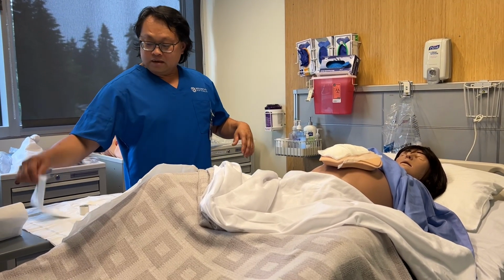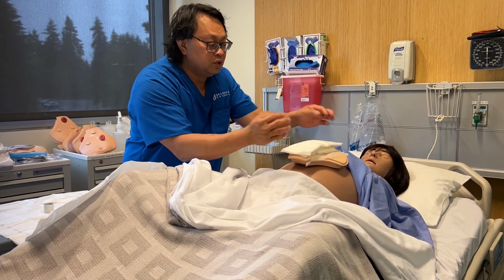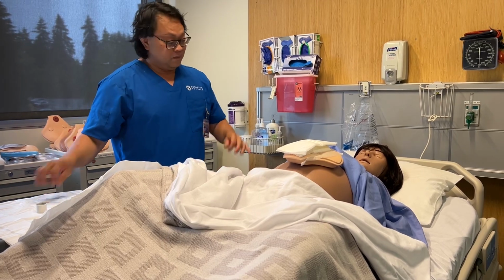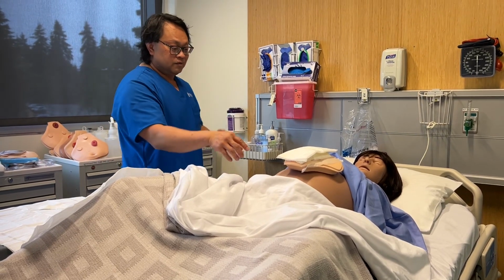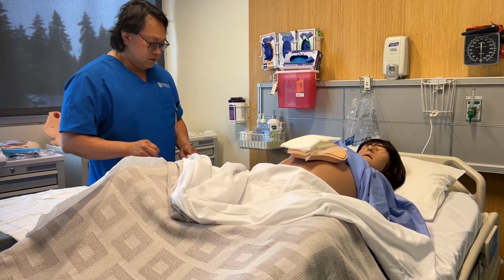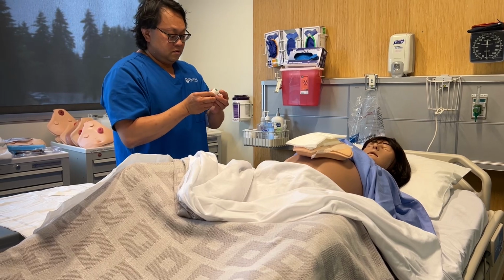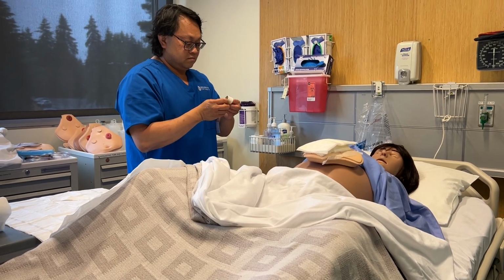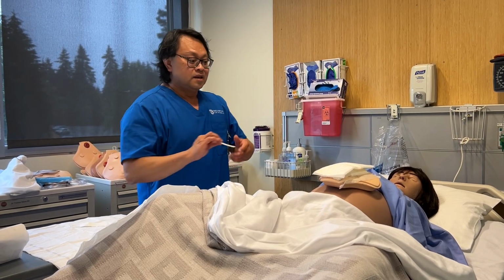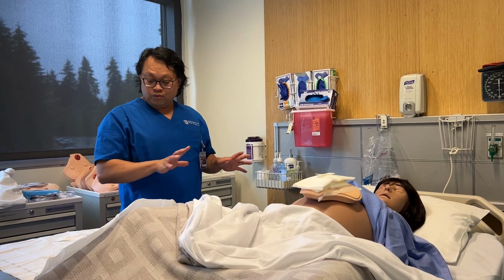I'm going to put my pad on with the blue facing up. And then I'm going to tape. Sorry, so the tape was wrong. And then I'm going to tape. I'm out of tape, but I'm going to tape. And then I'm going to document the date, the time, and where the wound was.